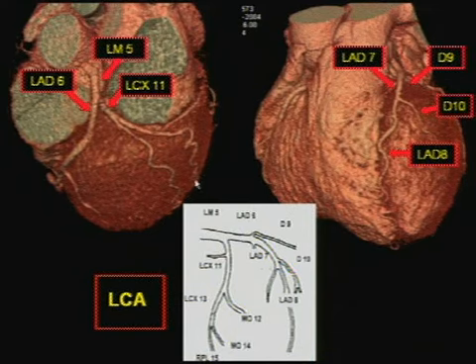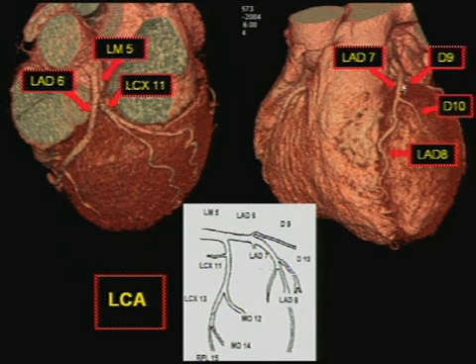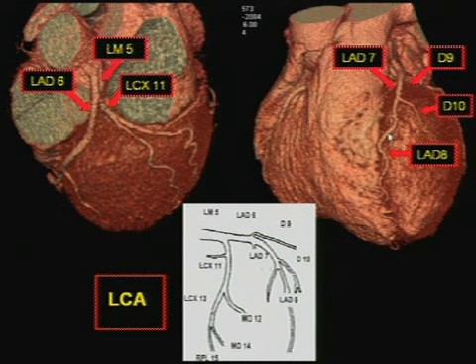On the left side, the left main is segment 5. The proximal LAD is segment 6. The LAD beyond the takeoff of the first septal perforator is segment 7, and the LAD beyond the takeoff of the second septal perforator is segment 8.